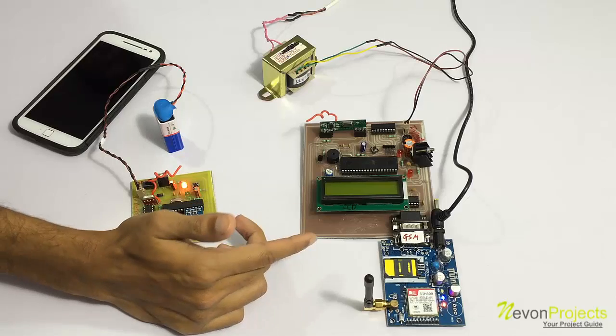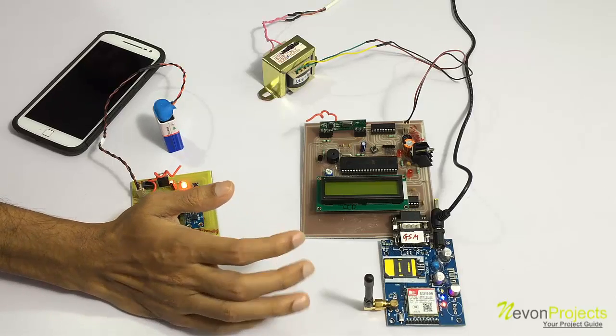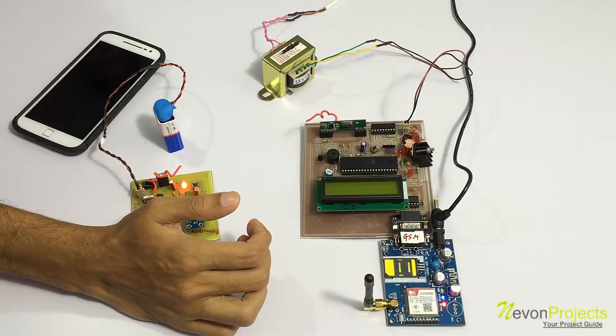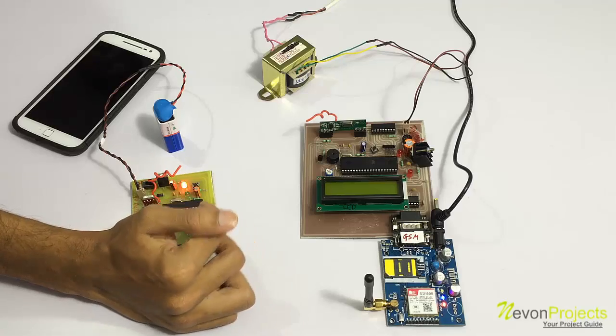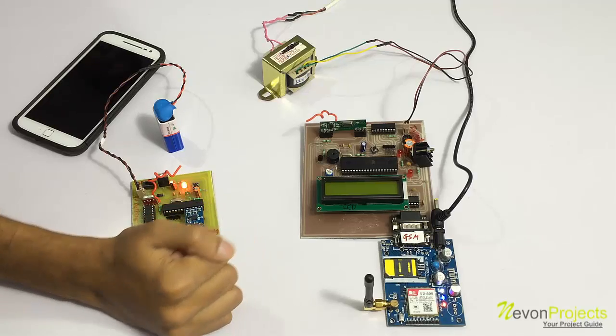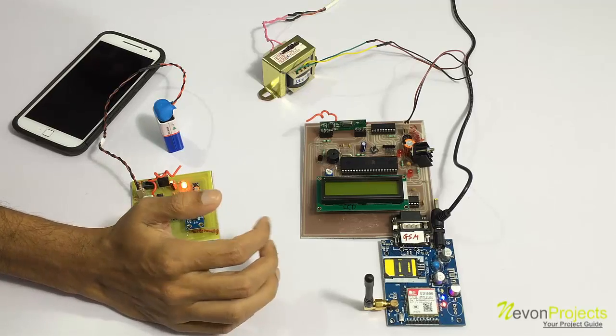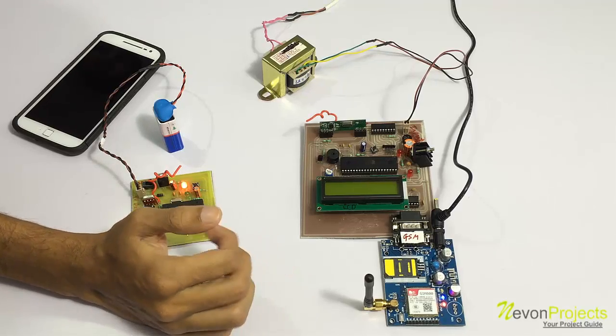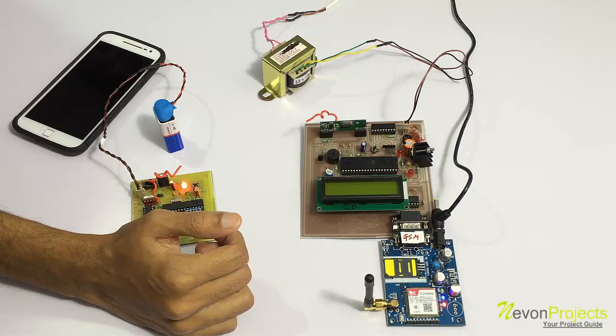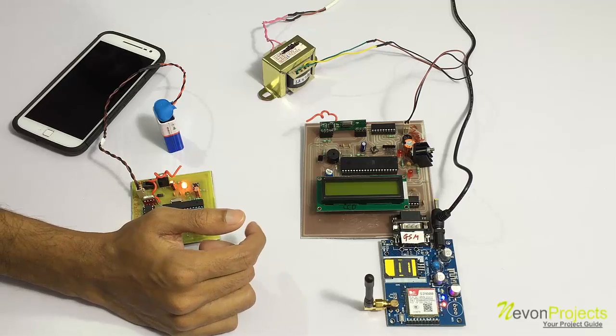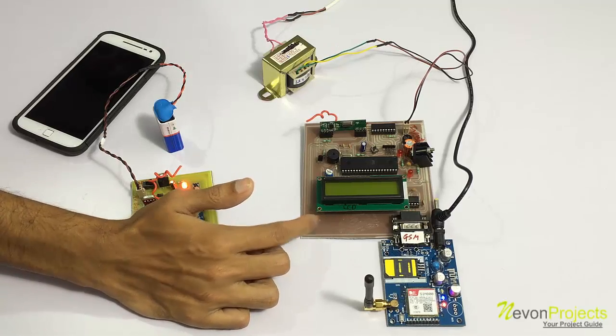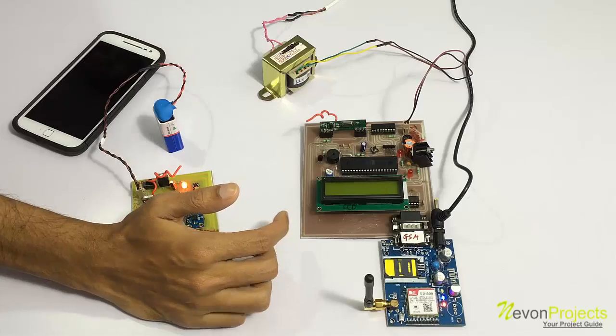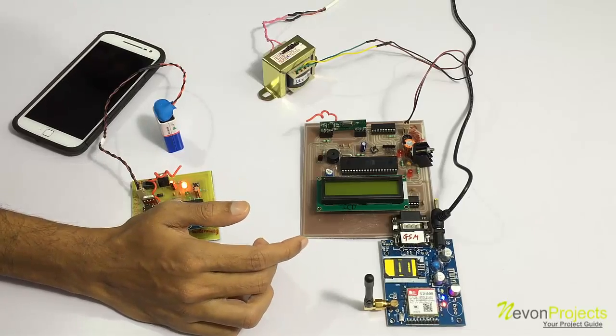As you can see, we also have a GSM modem. If the paralysis patient is not attended for a particular period of time, he can keep his hand movement in that particular position.